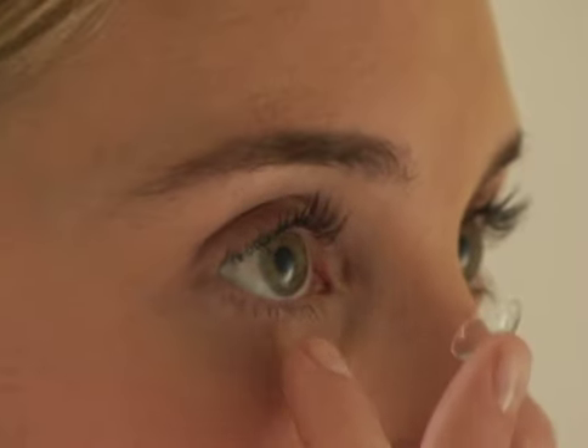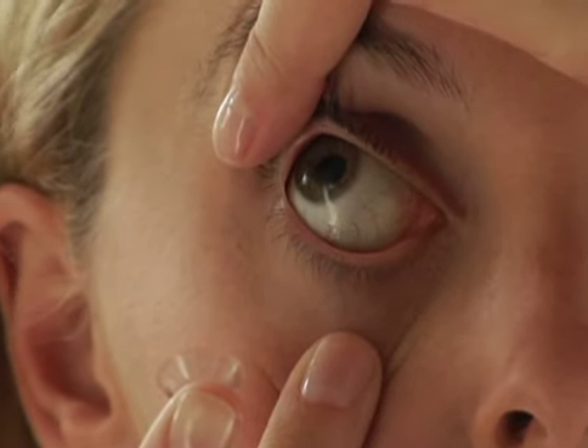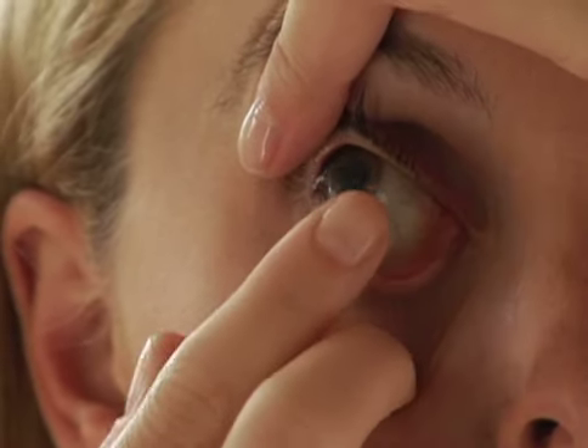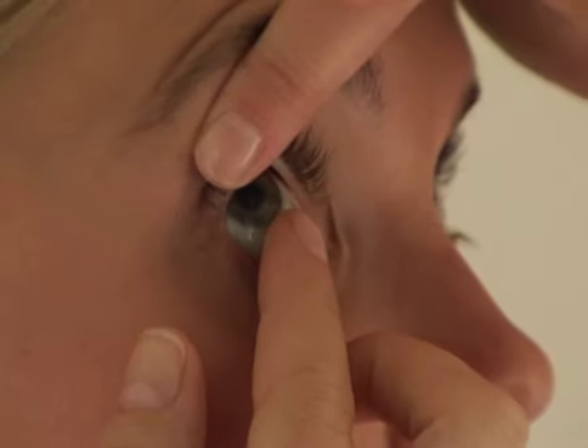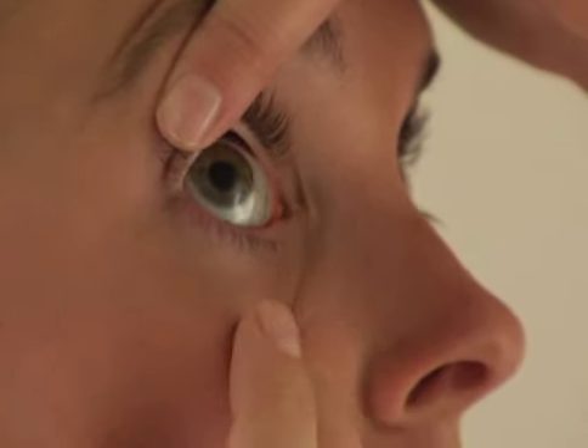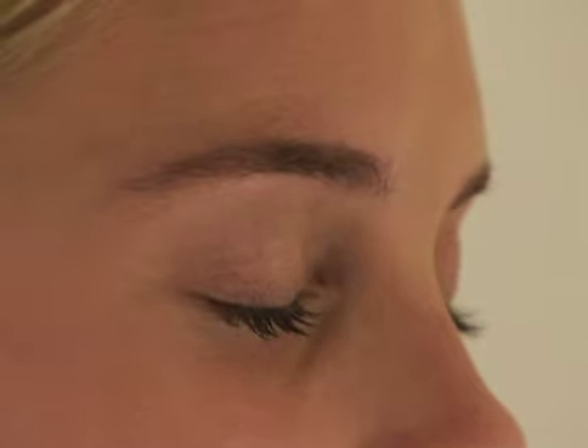Pull down your bottom eyelid using the middle finger of your right hand holding the lens. Now using the index finger of your left hand, hold up your upper eyelid and eyelashes to avoid blinking. Look up at the ceiling so that the white part of your eye is visible, and gently place the lens onto the white part of your eye without pressing it in. Remove your finger and let go of the bottom eyelid first. Look down to help position the lens and slowly release your upper eyelid. Now close your eyes for a moment, then blink several times to center the contact lens on your eye.